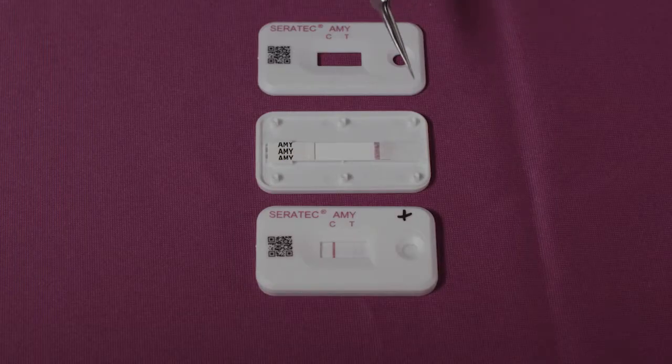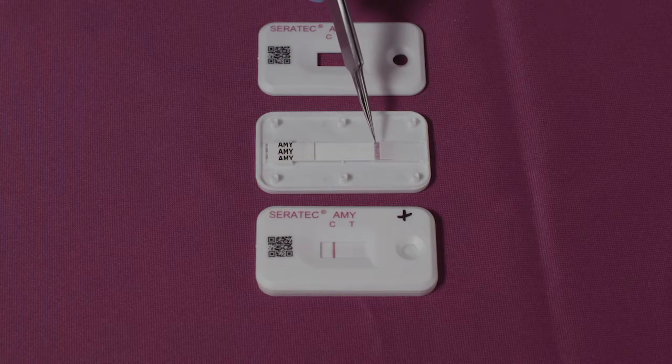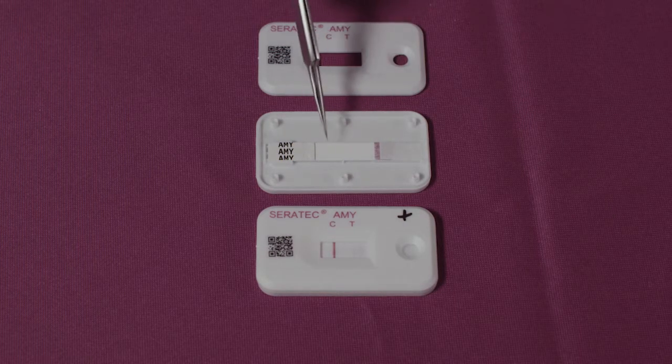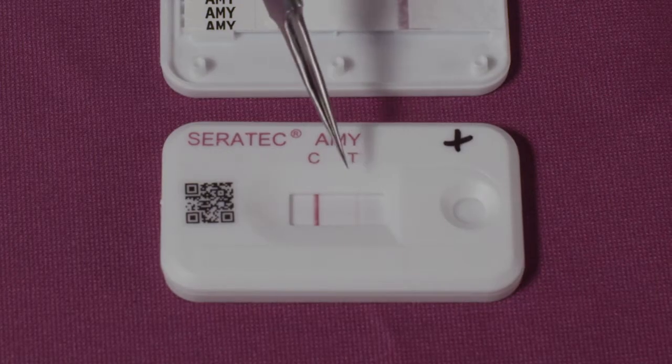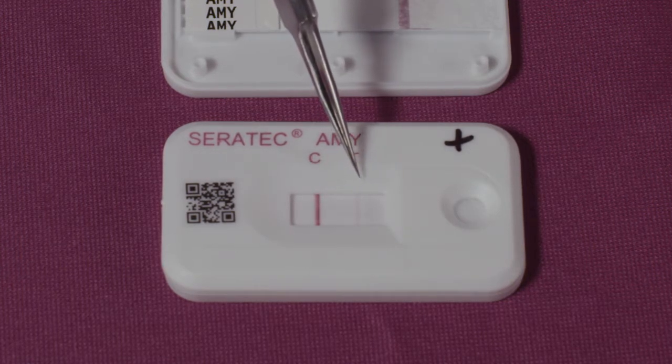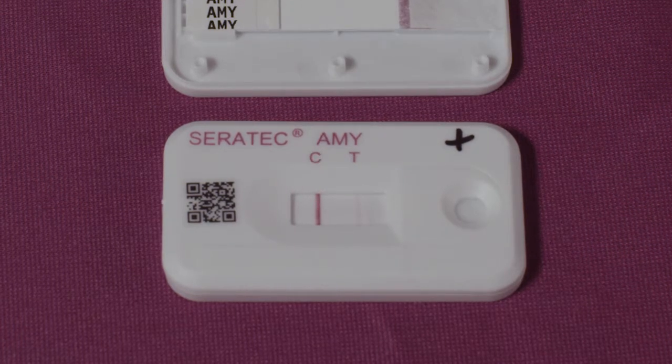The Seratec saliva test cassette consists of an absorbent pad, a gold-labeled mobile human-specific monoclonal antibody to human alpha-amylase, a nitrocellulose membrane, a second different fixed human-specific monoclonal antibody to human alpha-amylase, and a control line containing anti-mouse antibodies.